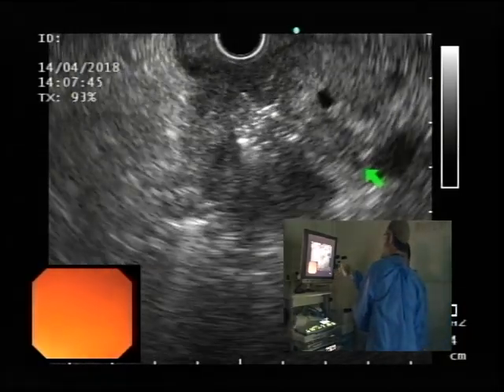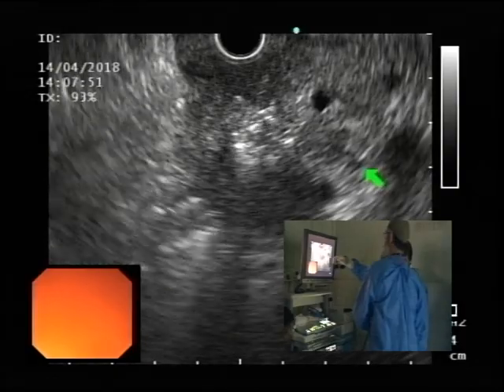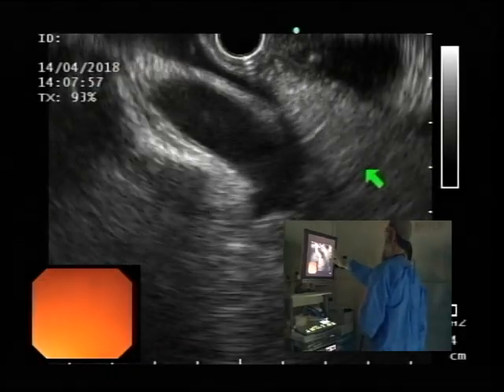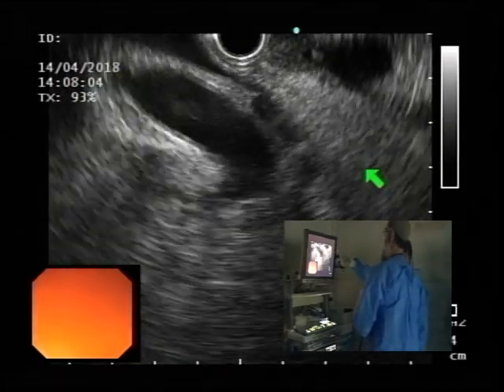I think what happened was you actually ended up reducing more as you did that because I wasn't fully reduced. So now go counter. There's bile duct. Now go clockwise. Now one choice is you can pull back a tiny bit now. And now go clockwise.